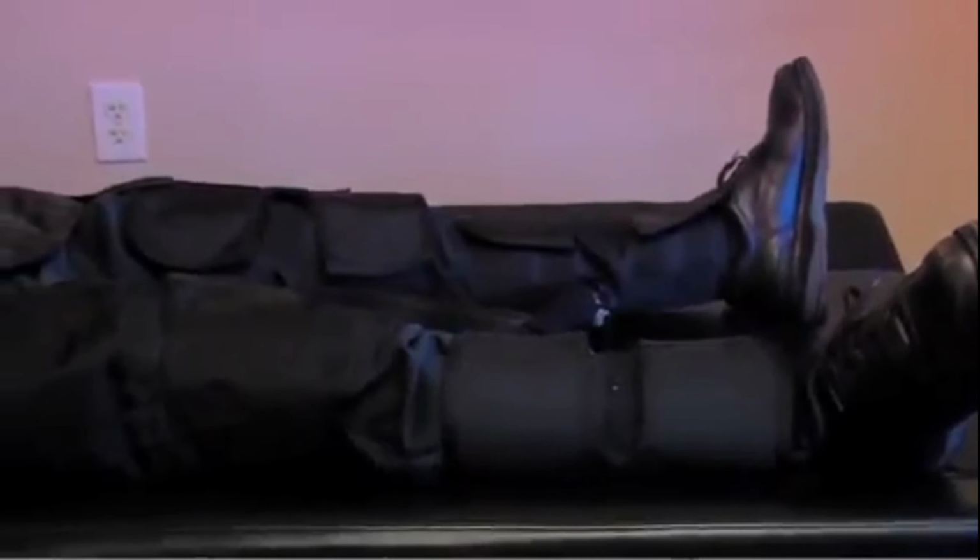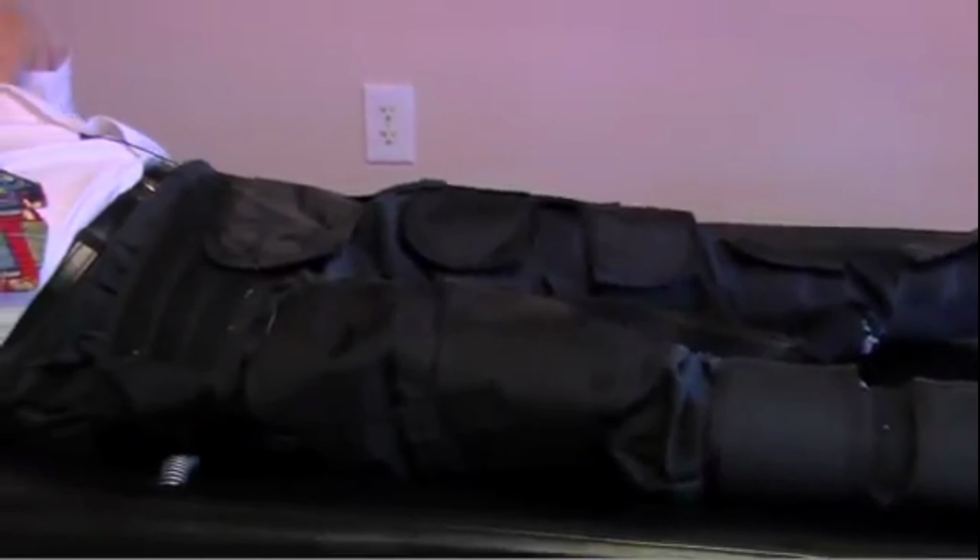And this machine right here is hooked up to electrodes on my heart, so the heart tells the machine when it is contracting and when it is relaxing. As the heart contracts, the blood goes from my heart down to my legs. In that moment that my blood is down in my legs, this machine turns on and these squeeze.